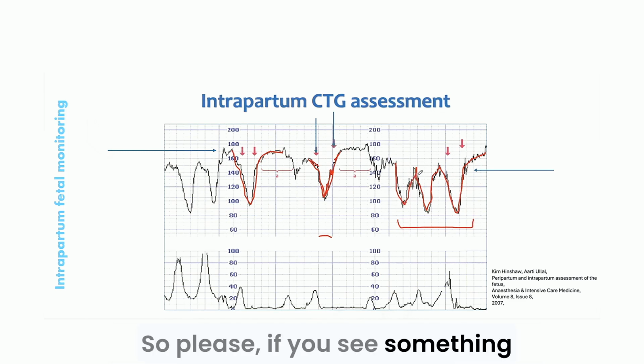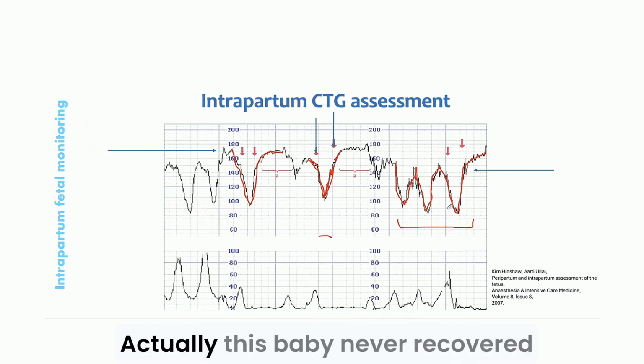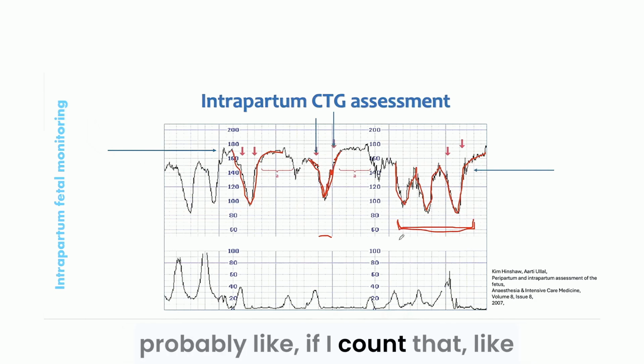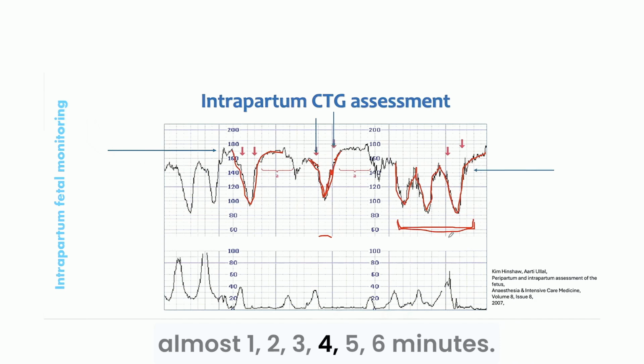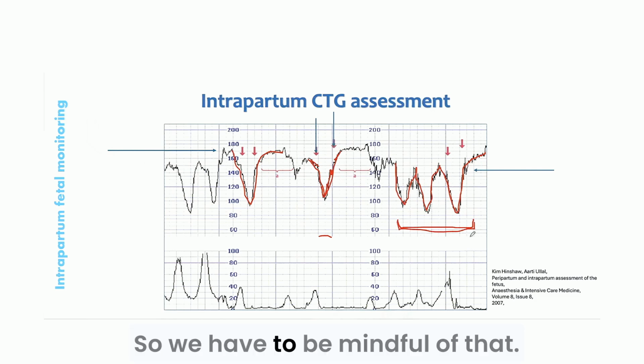So please, if you see something like that, don't take a breath and say, okay, it normalized and had another deceleration, normalized and had another deceleration. Actually, this baby never recovered to its normal heart rate for probably, if I count that, almost 1, 2, 3, 4, 5, 6 minutes. So that's a pretty long duration, and we have to be mindful of that.